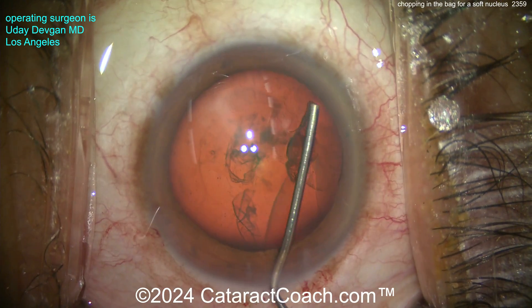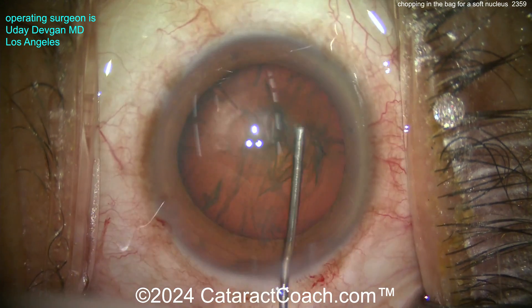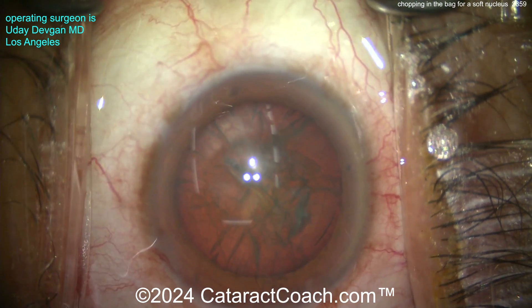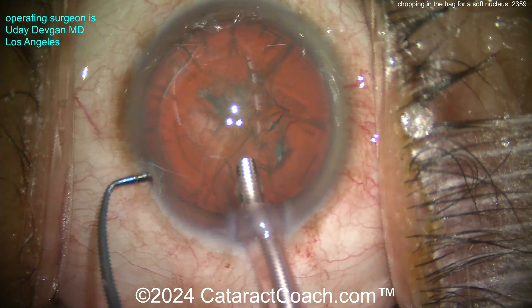Here we're going to do some hydrodissection, nice and gentle. Sometimes I can get the nucleus to come out of the bag — I tap it, get the fluid wave going across. It spins! There's the spin. As you know, the saying is: if it does not spin, you will not win. But that's definitely spinning.